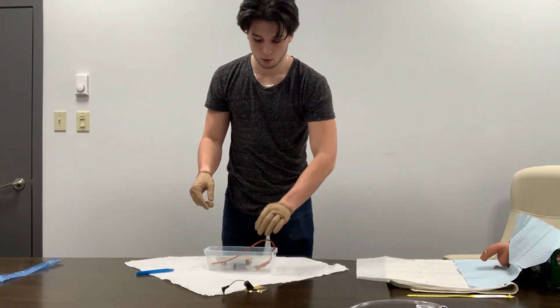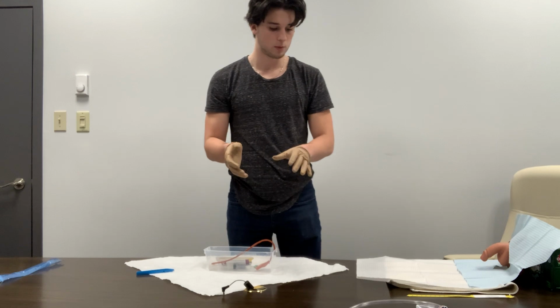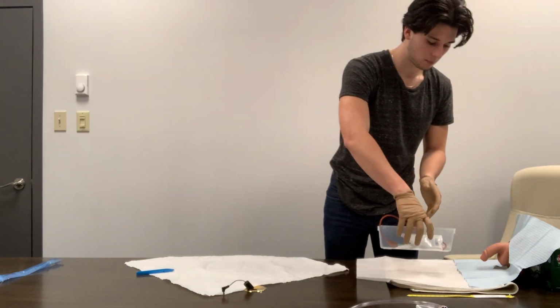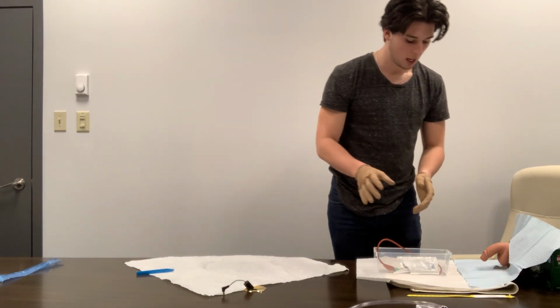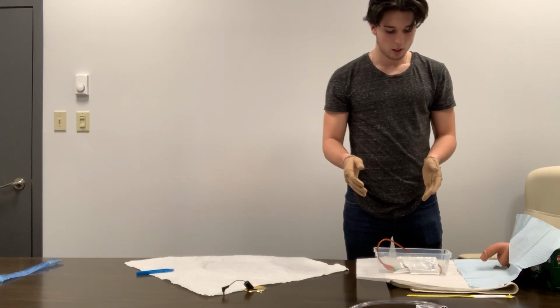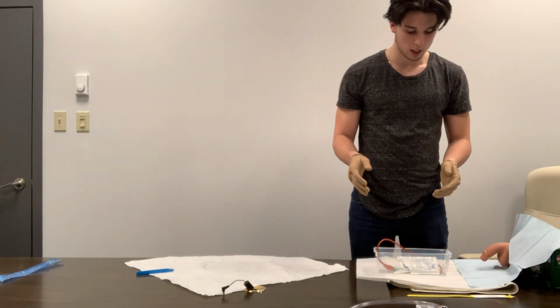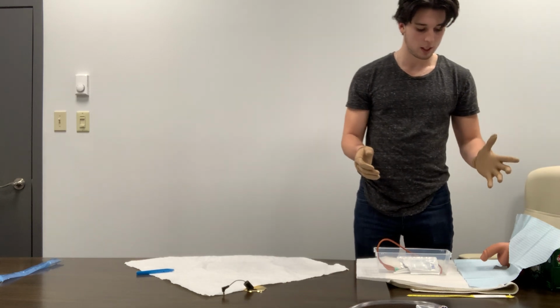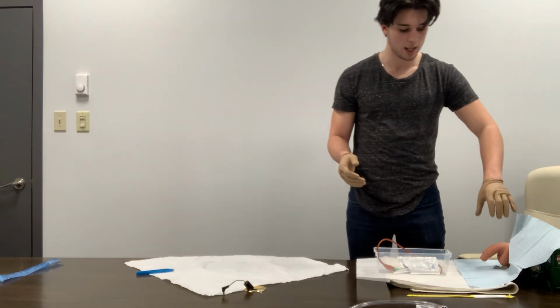At this point now, we can move our sterile field onto our other field in between the patient's legs. So I'm going to move this right near the patient so we have more access to work. So now that we are over here and ready to go, I am going to start by cleaning the penile area. So I'm going to grab the shaft of the penis with my non-dominant hand.